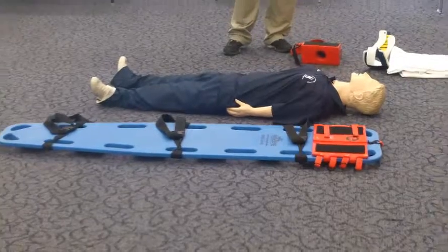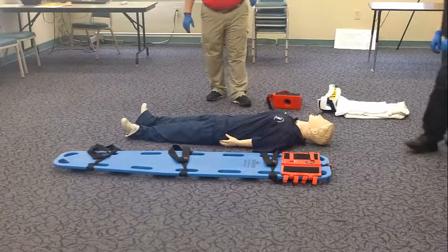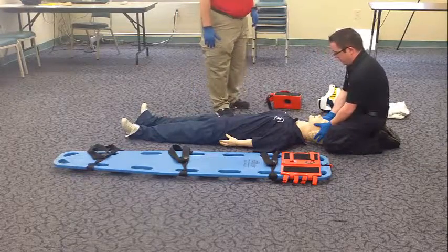My partner and I have taken BSI. Is the scene safe? The scene is safe. I'm going to direct my partner to place the patient in an inline neutral position and maintain that stabilization.